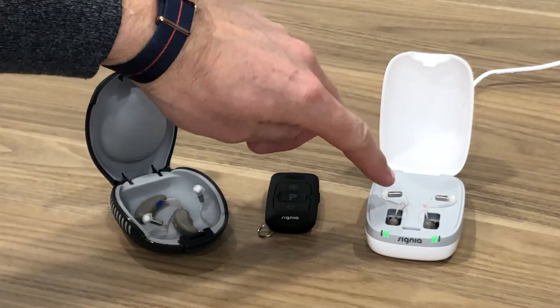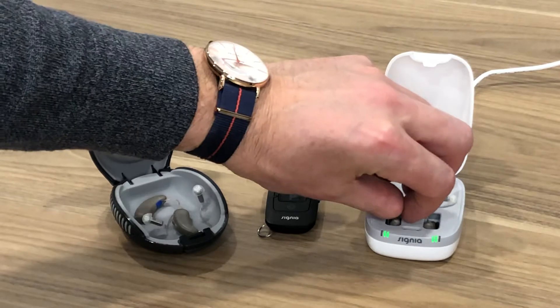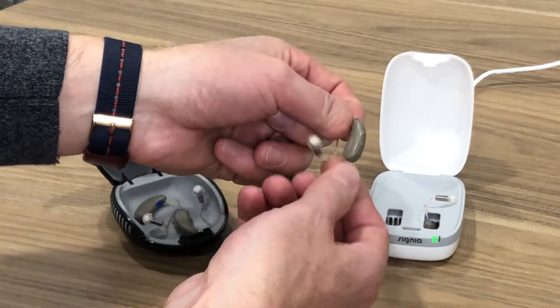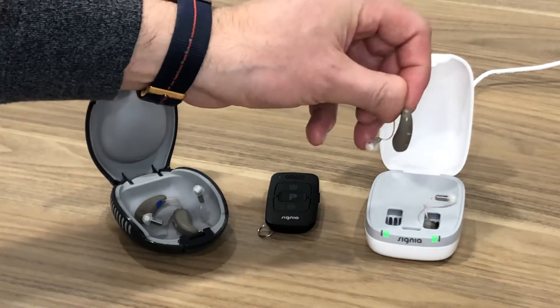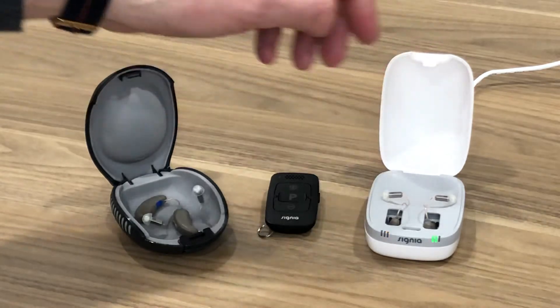Over here we have the Signia Pure Charge & Go hearing aids. It's a rechargeable hearing aid with a built-in lithium-ion battery, so there's no compartment to open. At the end of the day when you're finished wearing it, you slide the hearing aid back into the charger and it charges up while you sleep.